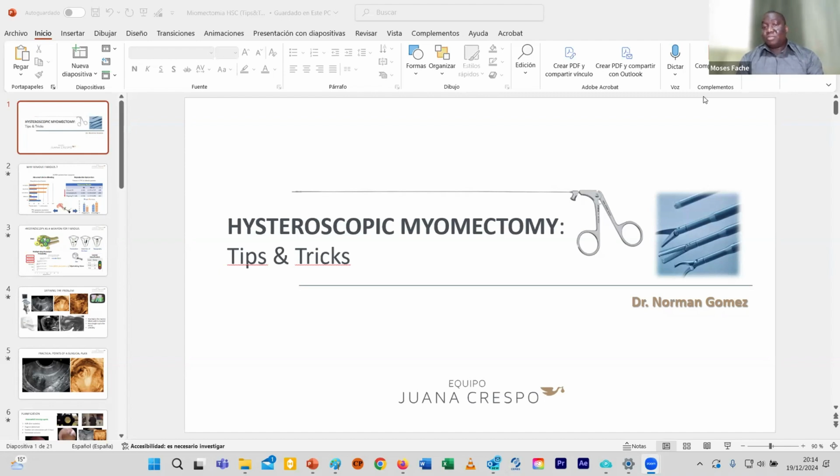There has been a lot of debate, maybe you just leave it. So what I can summarize of Professor Gomez's technique is like doing laparoscopy hysteroscopically. That's what he has demonstrated today, where via the hysteroscope you can dig into this myometrium by removing just the endometrium, and then you're able to either extract the fibroid from its cavity and then morcellate it.